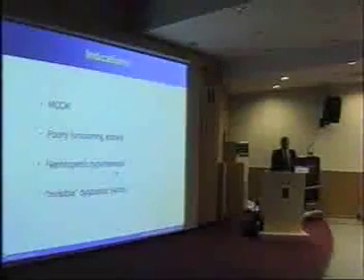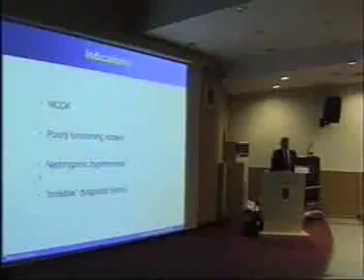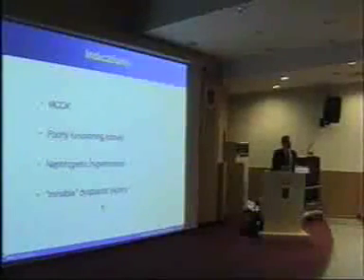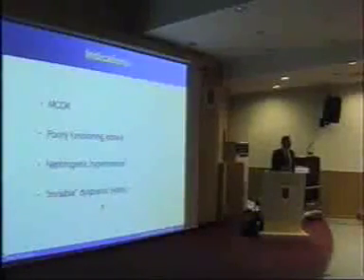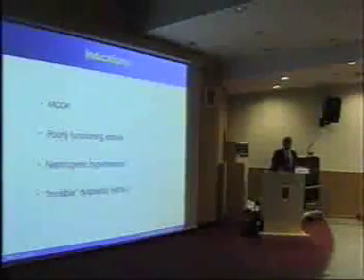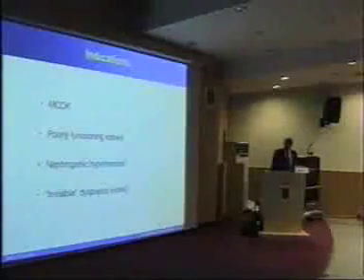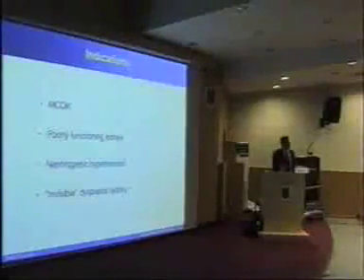But generally they don't have a lot of fibrosis around them. And the invisible dysplastic kidney, well, this is really continuing on from an exploratory laparoscopy looking for this ectopic kidney as a cause of incontinence, and you take it out when you find it. But you work through your indications, but start off with multicystic dysplastics.